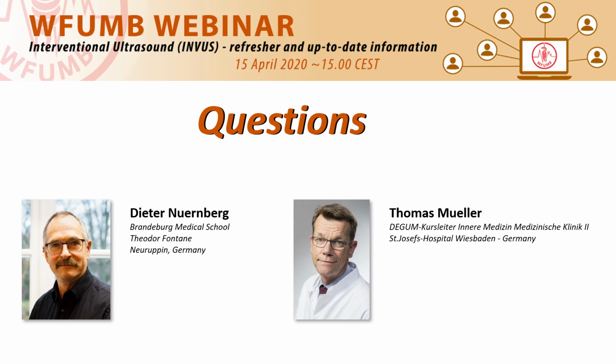I very rarely use fusion systems, because most of the lesions I want to perform biopsy on are visible on ultrasound. You have to do sophisticated ultrasound, and the second indication would be if, for example, there is a liver lesion visible only on CT scan and not on ultrasound, and I want to perform ultrasound guided puncture, but I rarely do it. So prostate biopsy is the most important indication for fusion imaging in interventional ultrasound at this time.